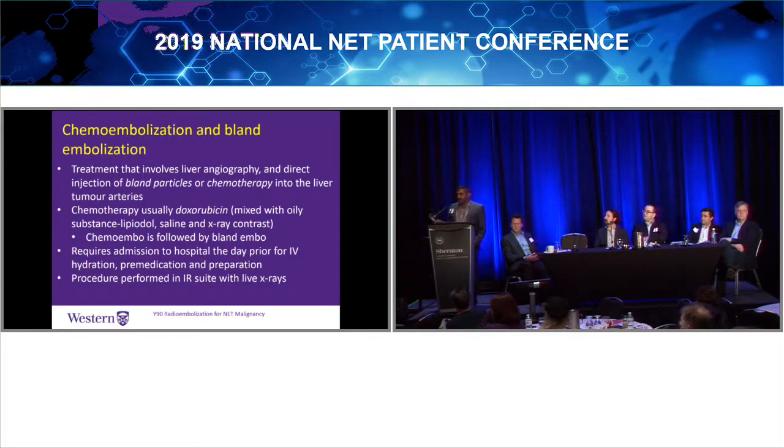So different centers will do things differently. Certainly a lot of centers will do what's called bland embolization, where they take these plastic shavings, mix them up with some X-ray dye, and inject them into the tumor. At our center, we tend to do more chemoembolization, where we mix chemo with a poppy seed oil derivative and inject it into the tumors. Either way, we want to see where it's going.